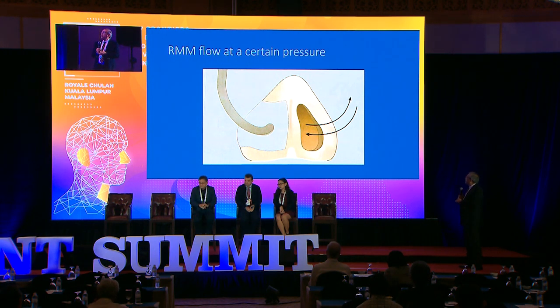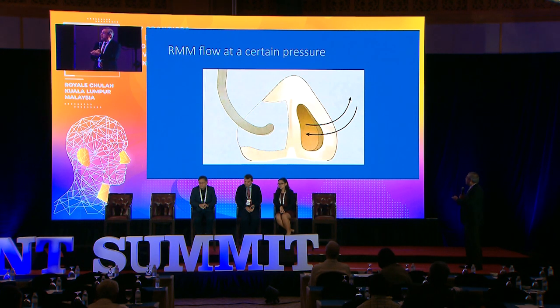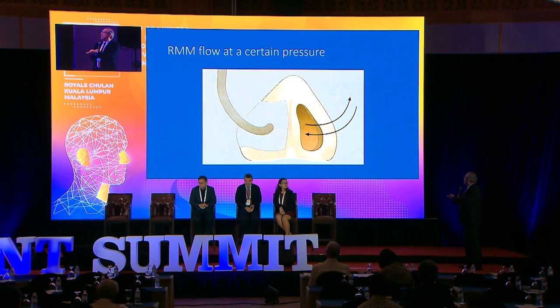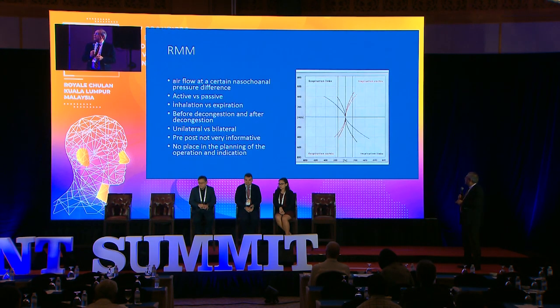This is rhinomanometry. It's the measurement at a certain pressure: you close one nostril, and then you measure the flow on the other side. So this is airflow.